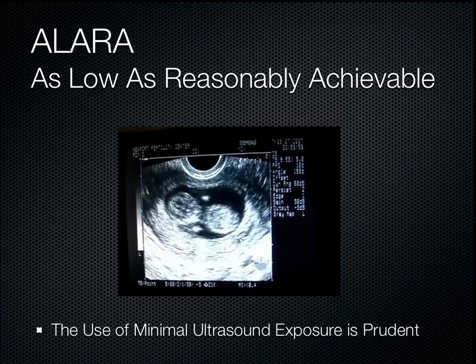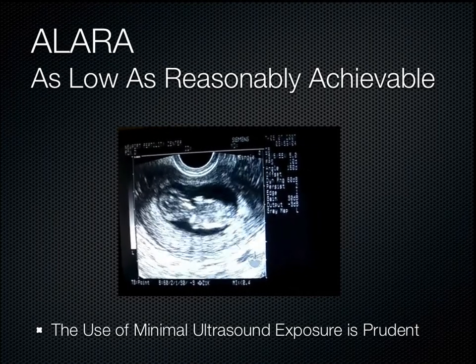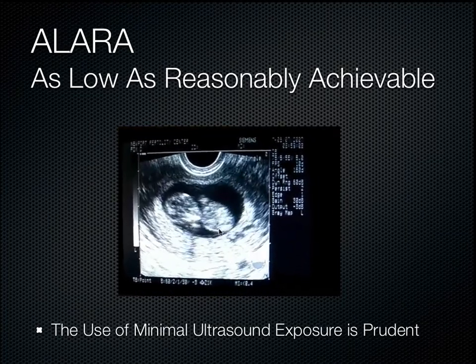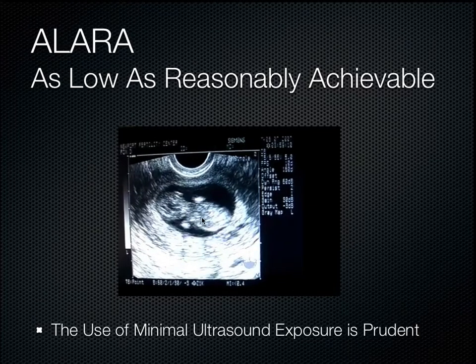And something could be said about ultrasound. The minimal use of ultrasound exposure is certainly prudent. This is my son, Nicholas, here when he was in utero. I don't know, around 9 or 10 weeks or so here, oh no, probably less actually. We're using the endovag probe here. This looks like he's probably about 9 weeks or so, and we tried not to use ultrasound on him that much when he was a fetus.